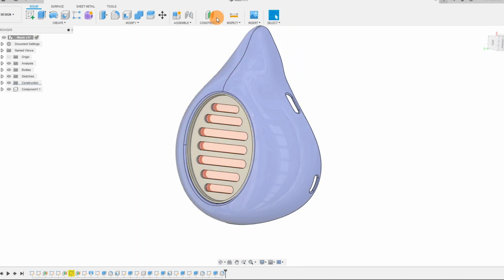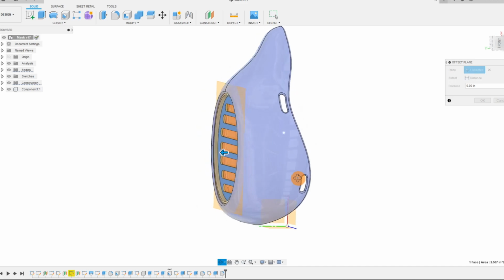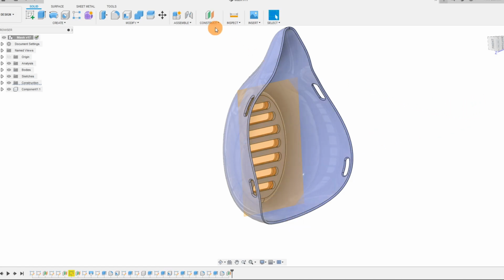The way we're going to do that is I'm going to come to Construct, Offset Plane, click on this flat surface, and I'm going to drag this inward. So I'm just going to drag this back a little bit, and I'm going to drag it to about here. We can type in negative 0.5 for now and hit OK.